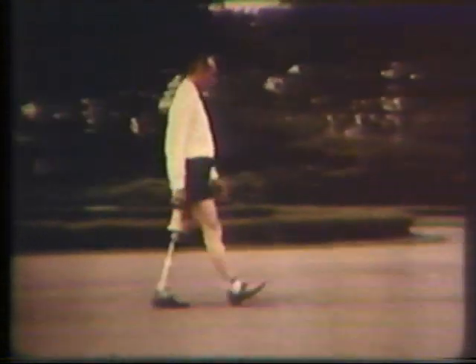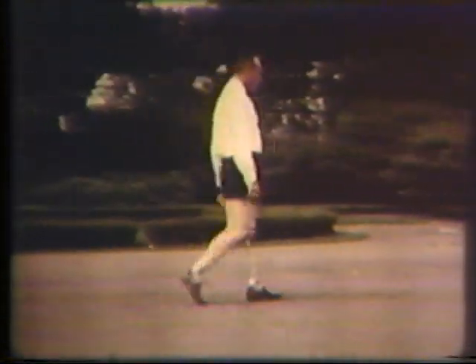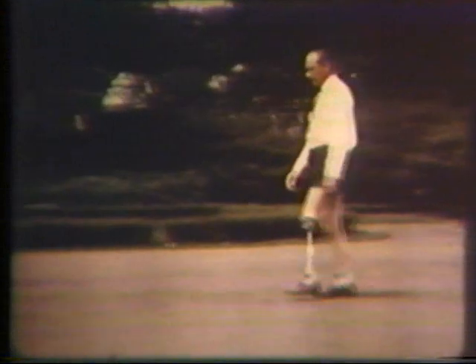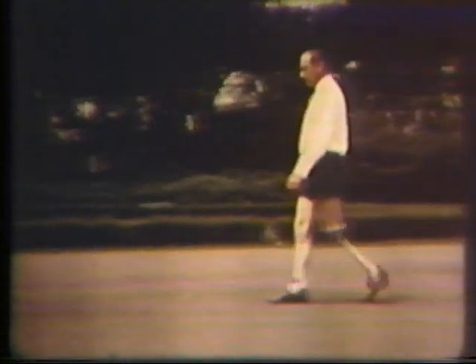The subject now has the prosthesis adjusted to the optimum alignment. The length is correct, the knee is aligned correctly, and the socket angle is proper. There are no defects in the prosthesis at this time.